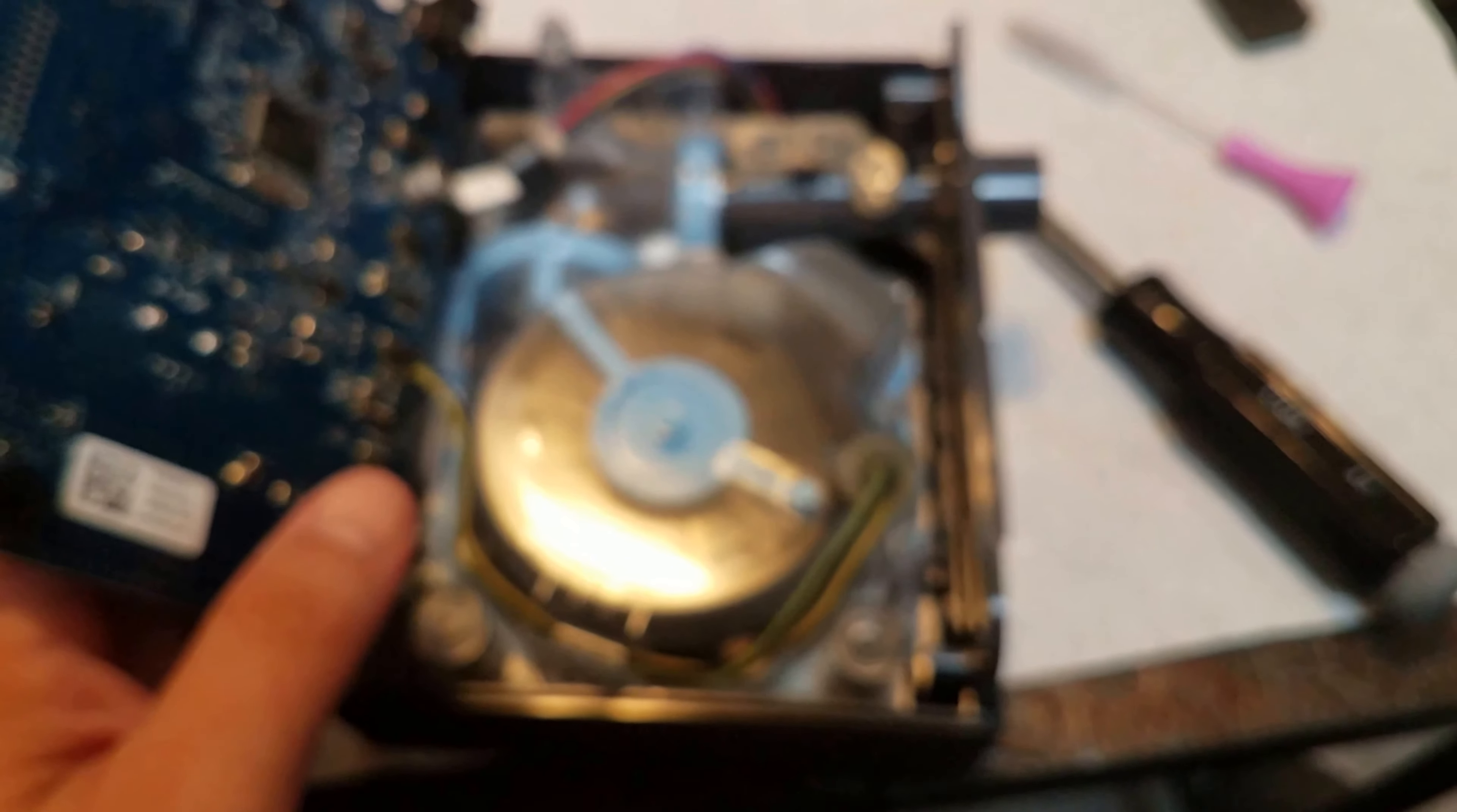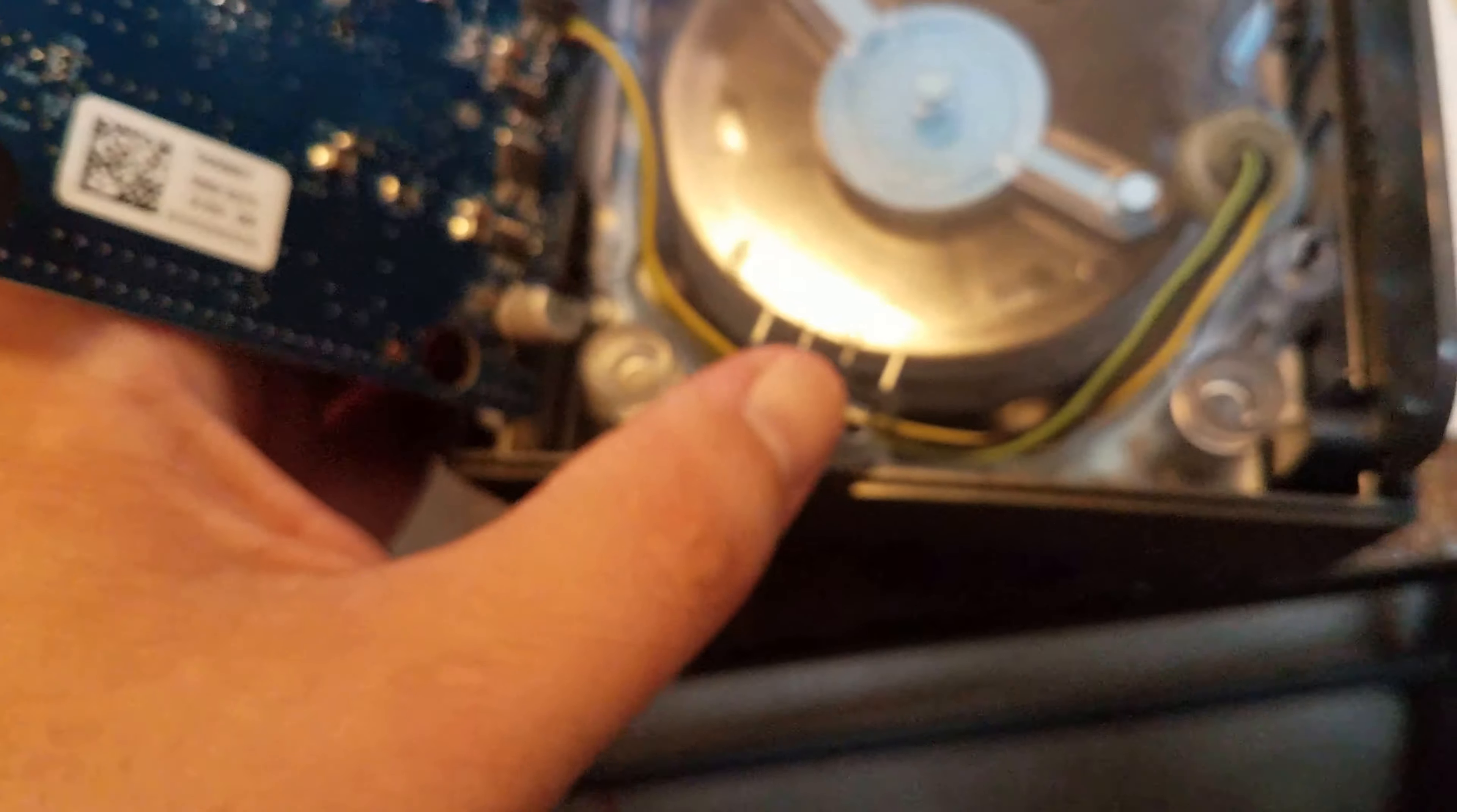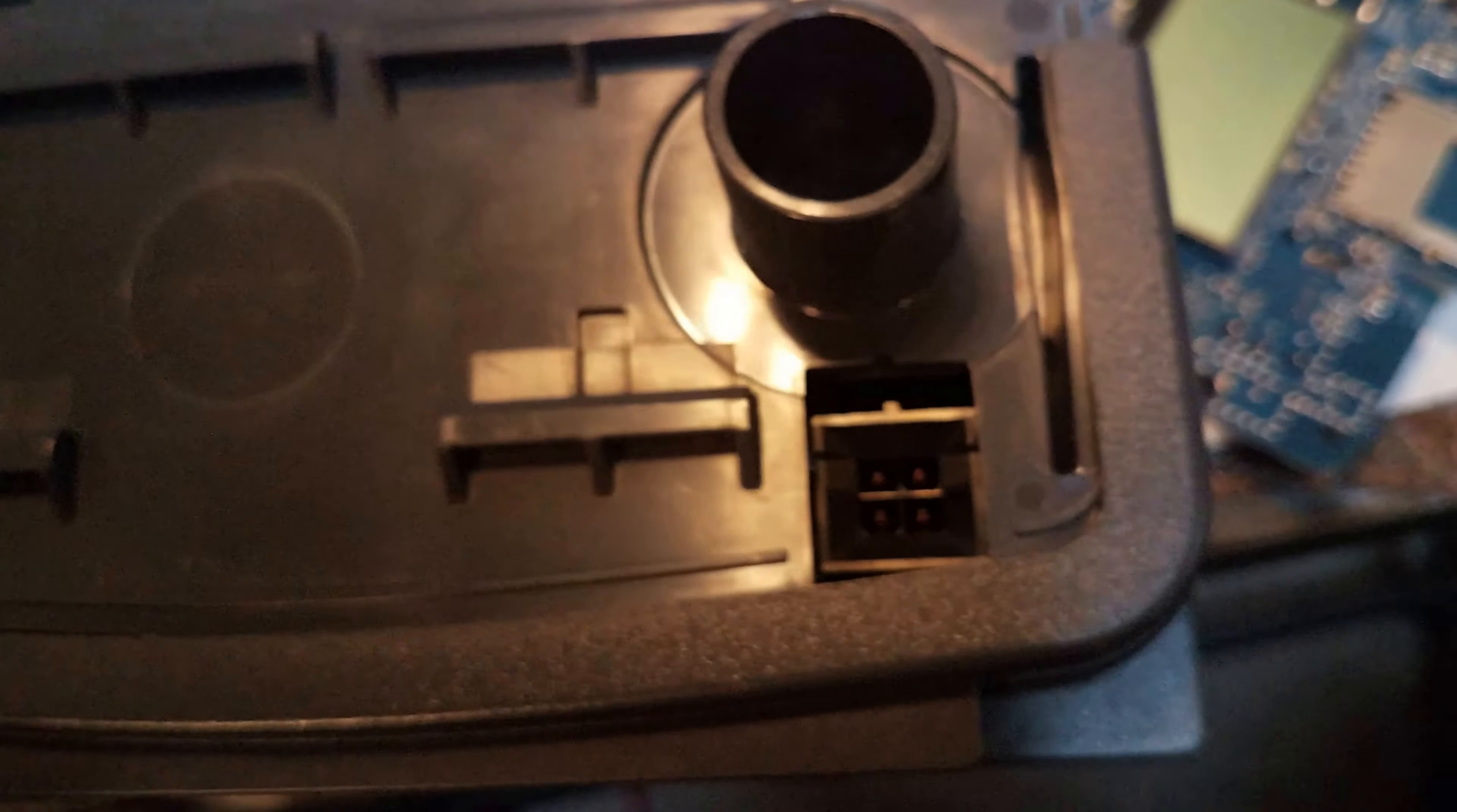The board wasn't sitting down well before because some of these wires were sitting on top of this housing. It fits pretty darn close to that housing, so there's not really room for wires to be laying on top. Again, I did tuck them here, but there's still a little bit of slack. If you're having issues, maybe that's the reason.